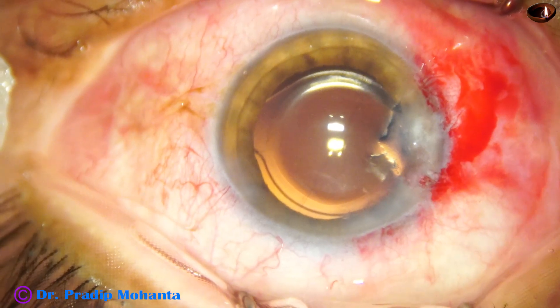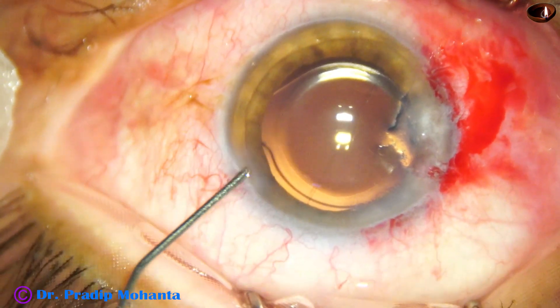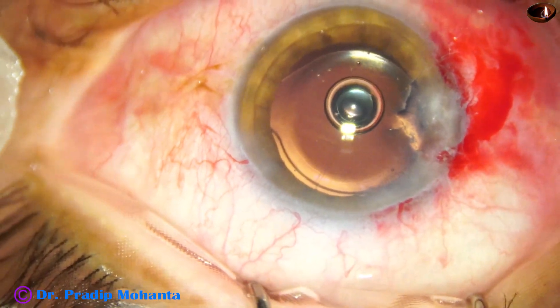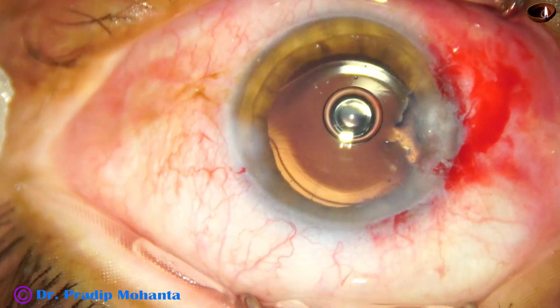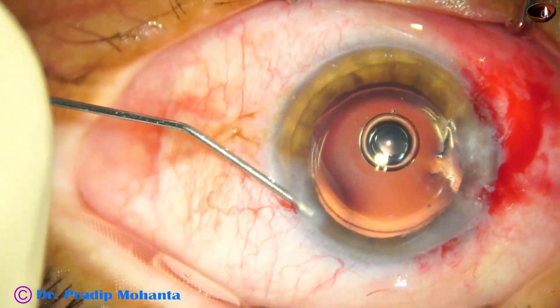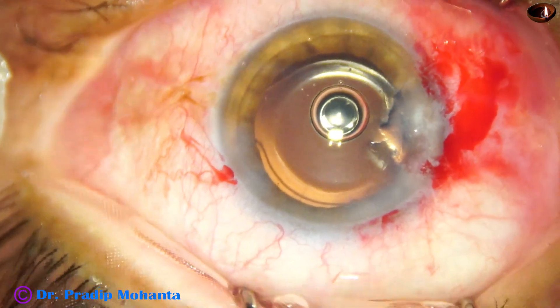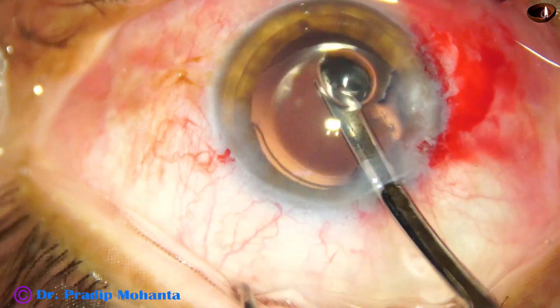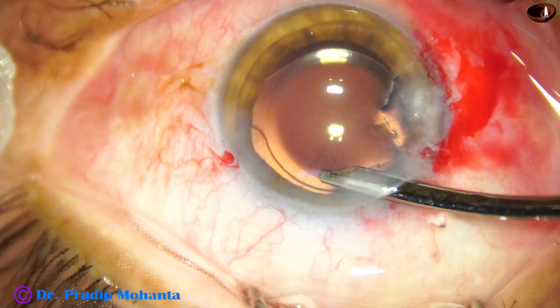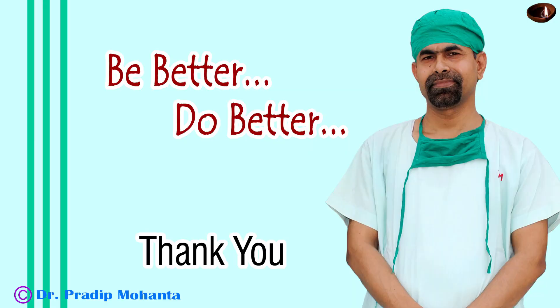Now we have to close the side port. This is a bit of moxifloxacin. Now I take BSS and close the side port, followed by final cleaning of the visco and formation of the anterior chamber. Thank you very much for your attention.